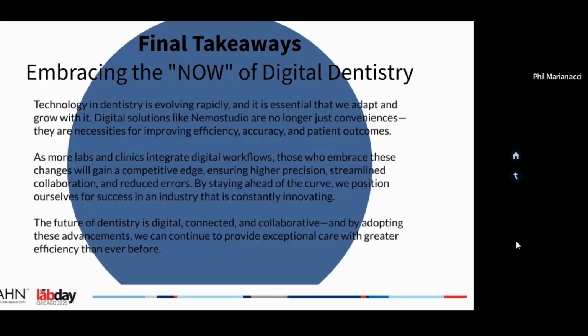In bringing this type of education to local study clubs, and really build up your lab, because it works. This communication, doing surgical guides, which then therefore means you're doing cases that are all on X cases. This is what you want to shore up your lab doing these cases. I highly recommend it. So if you're looking for a way to differentiate yourself and create value, you need these things for the future.